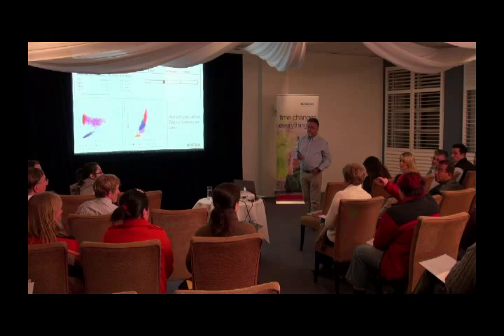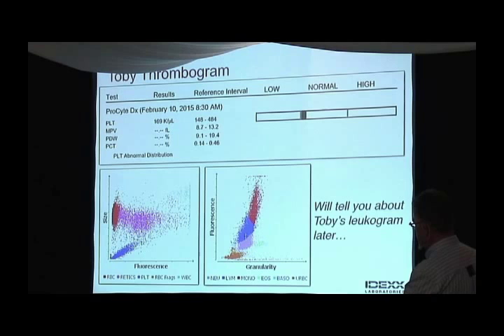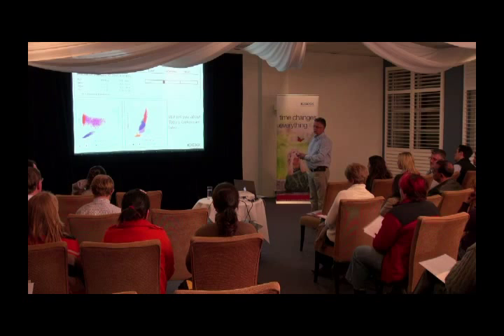It's all three colors there at the back. Here, the instrument is not sure if they are neutrophils, lymphs, or monos. So all this is a nice inflammatory leukogram, and those are probably metamyelocytes or extremely toxic neutrophils. Remember, if you have a lot of Döhle bodies, those things glow, so they will move all the way up to the top floor.